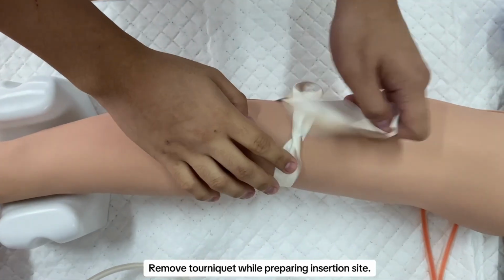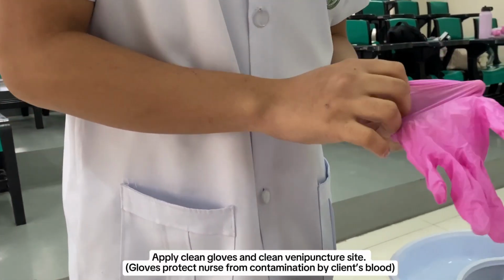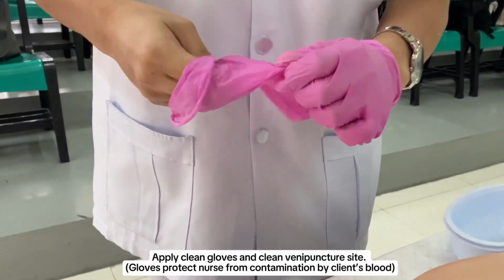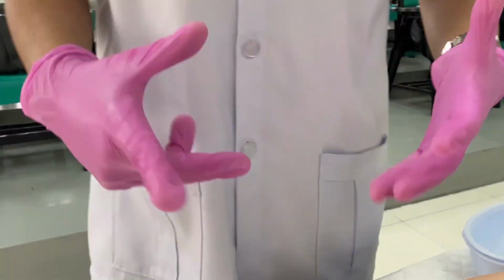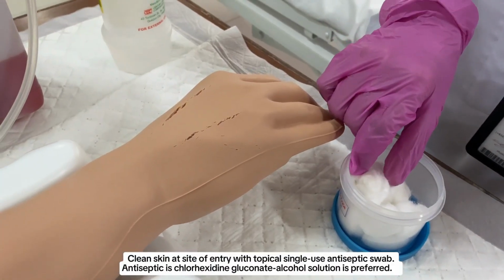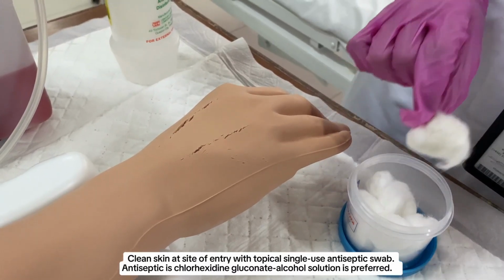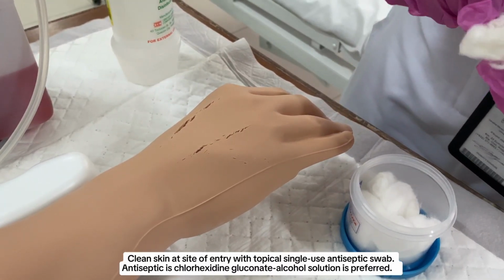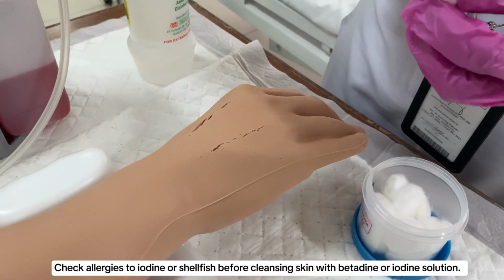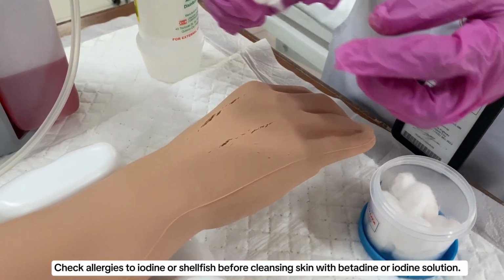Remove the tourniquet while preparing the insertion site. Apply clean gloves and clean the venipuncture site to protect the nurse from contamination caused by the client's blood. Clean skin at the site of entry with a topical, single-use antiseptic swab. The preferred antiseptic is chlorhexidine gluconate alcohol solution. Check allergies to iodine or shellfish before cleansing the skin with betadine or iodine solution.